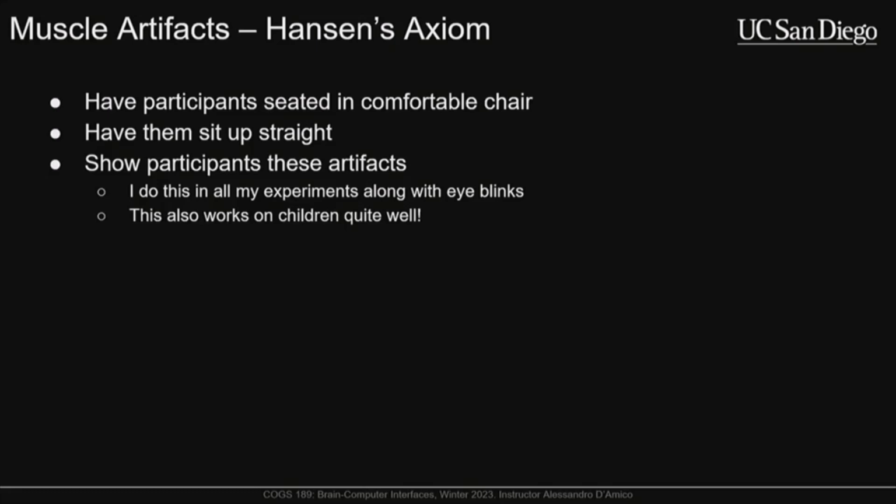You can re-reference to anything you want. As long as the data are in the same magnitude and they're recorded from the same amplifier, then you can re-reference it safely. The reason I specify that is because often we're recording EOGs through an aux amp that is pre-amplifying the EOGs. So now we're dealing with signals that are in the millivolts range rather than the microvolts. So you'd have to apply some gain correction to those before you would re-reference.